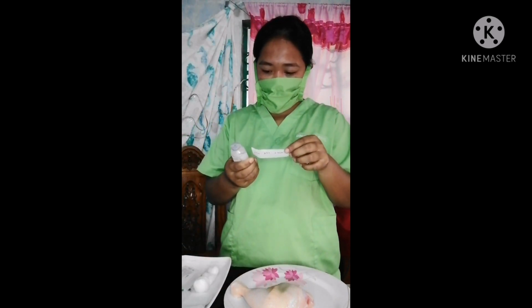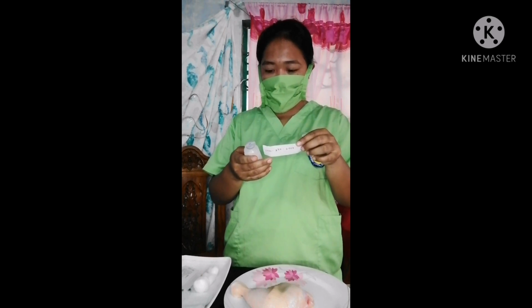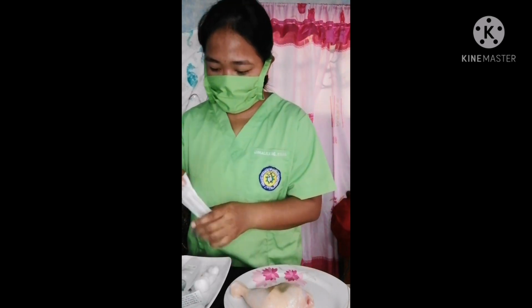Compare the MAR to the medication. Then next, if necessary, withdraw the medication from the ampule or vial as described in the previous skills.